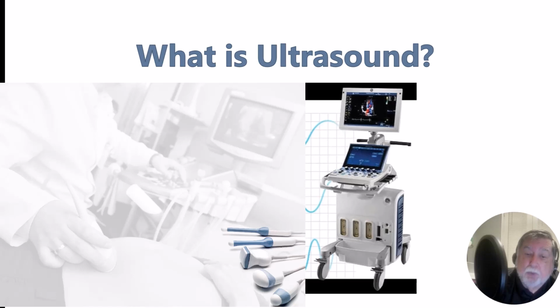A 7.5 megahertz is typically used for breast or thyroid imaging, and a 10 megahertz is breast, thyroid, and superficial veins. Because remember, the higher the frequency, the more superficial we are recording because it's not penetrating as much.